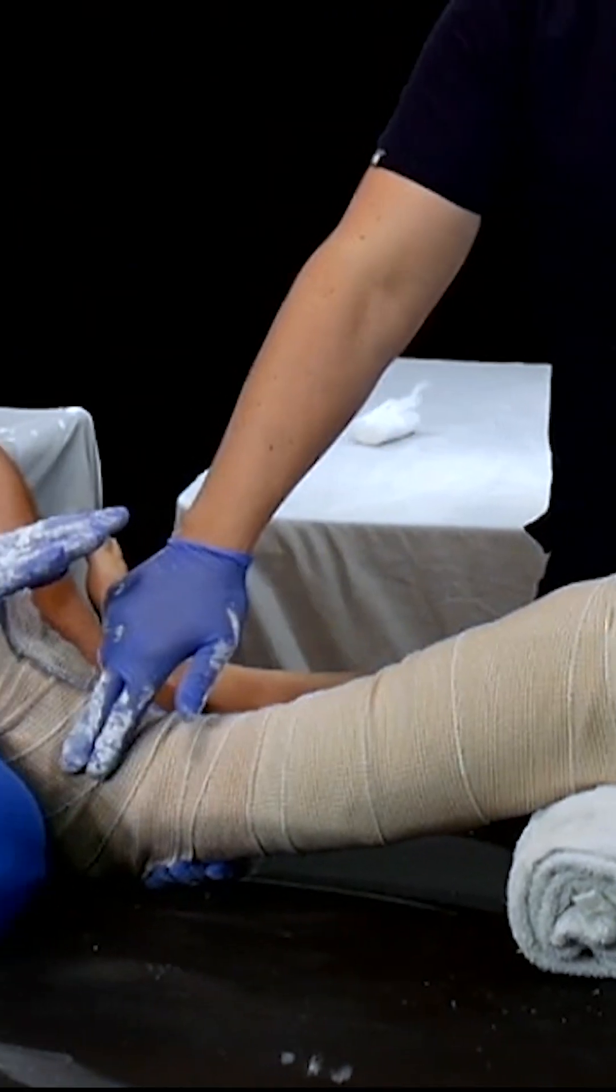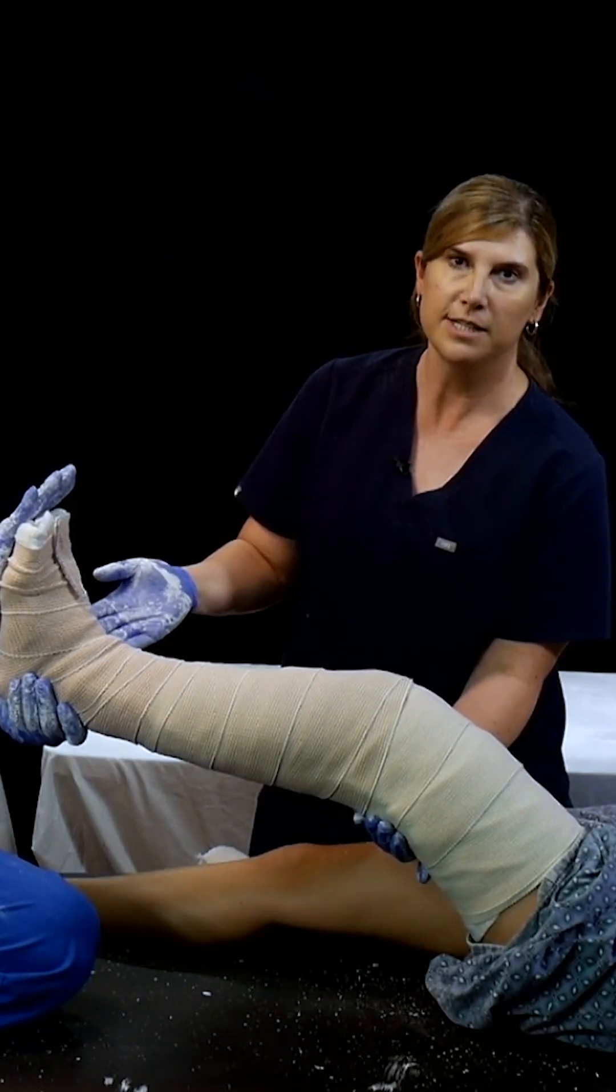5 to 10 degrees at the knee, 90 degrees at the ankle. So once again, this is a posterior long leg splint.